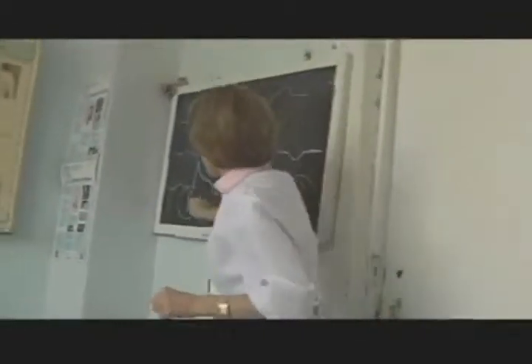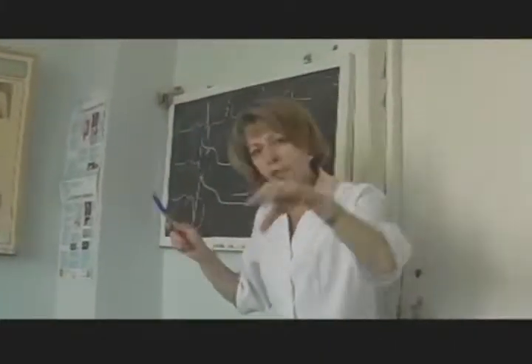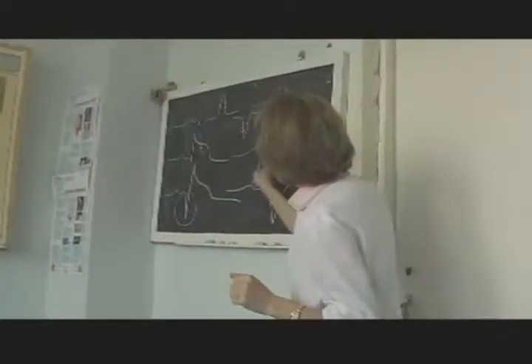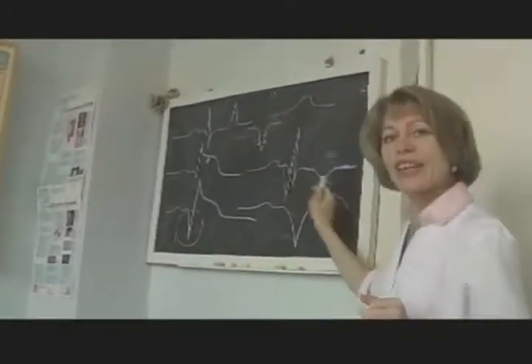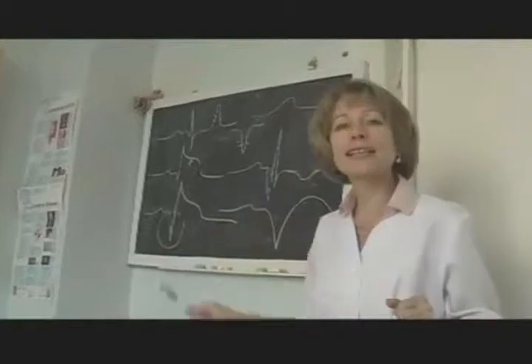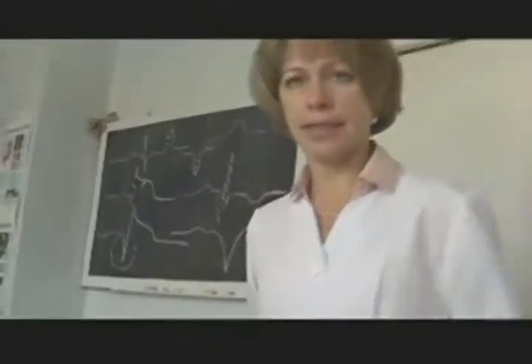If the ST segment is on the isoelectric line, you exclude damage. Then we'll pay attention to the deep Q wave. And see, if the Q wave is accompanied with a rising ST segment, it's acute myocardial infarction, necrosis. If you reveal only a Q wave but the ST segment is isoelectric, it indicates post-infarction cardiosclerosis. This patient doesn't need active therapy.